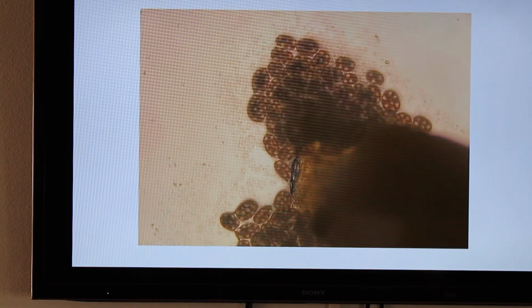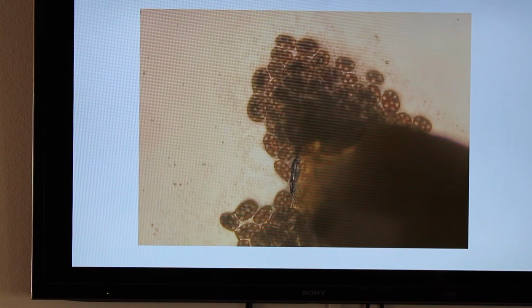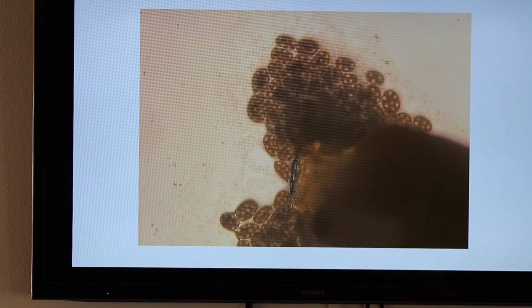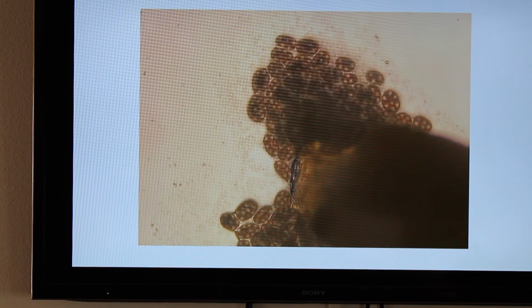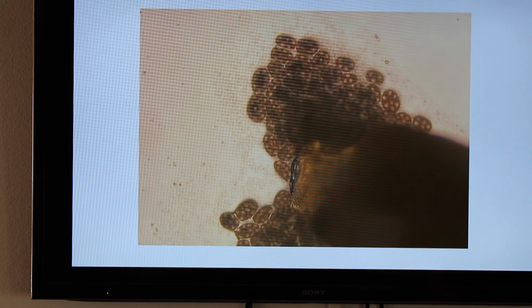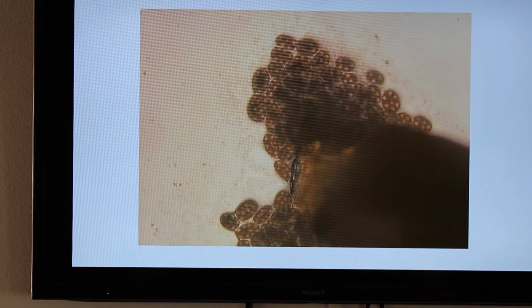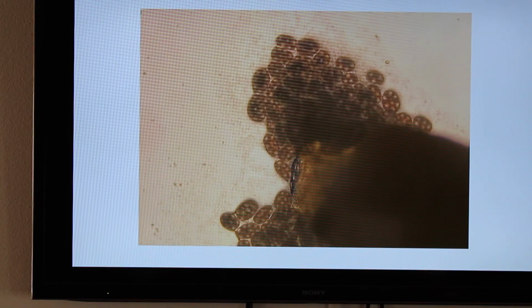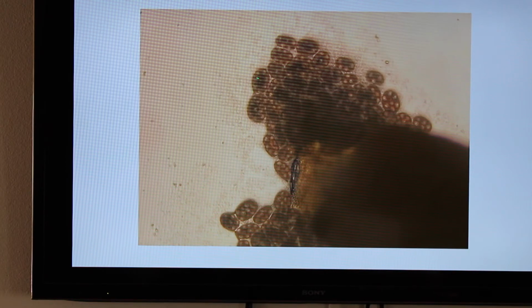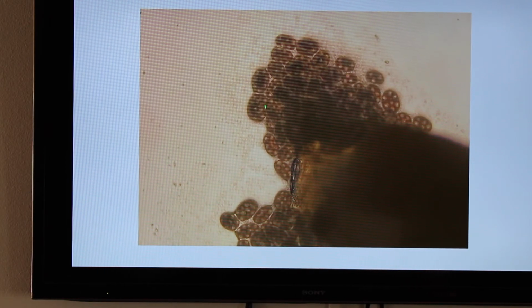This is the image I showed to you guys earlier in the semester. It's a tapeworm, or Dipylidium caninum. And these eggs are usually too heavy to float. So we usually see them in a direct, or in this case, I actually physically put a tapeworm onto the slide and it squished all of its eggs out. And then you can see they're different in the fact that they don't have one individual egg shell. They're like little egg packets.